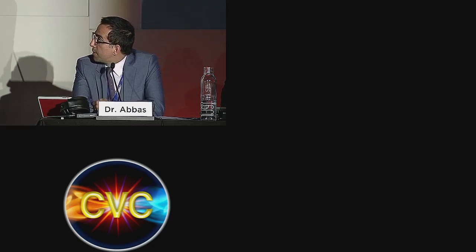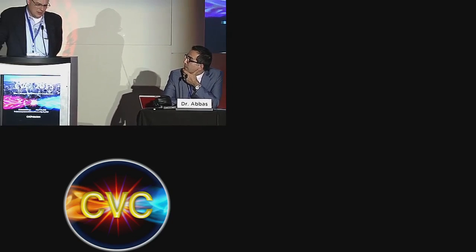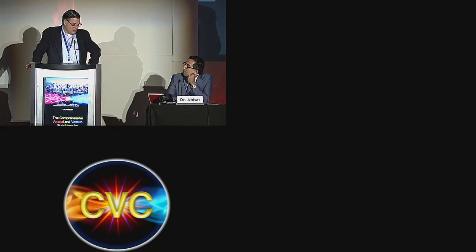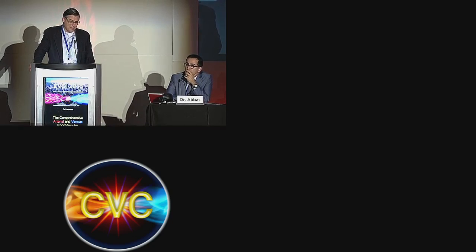I think that, to me, is the biggest thing: what's their runoff and what's the clinical scenario. If they have critical limb ischemia and you're going to use any device, I would really try hard. And I think the issue, as Eric brought up, is if you can get it there, because a lot of times you're trying to drill things that are way downstream, and it's quite challenging. But you can get debris absolutely from any device, and even things that say they suck out the debris. You put the filter down, you'll get a lot of stuff.